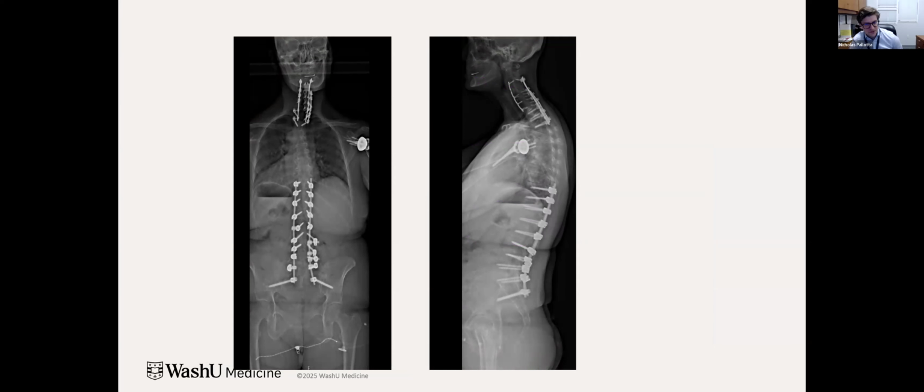And I used patient-specific rods in her, and you can see that whereas in the previous case I had a lot of coronal bend in the rod, especially on the left here, you could see laying in a straight rod and using offset connectors to maintain that, and then placing the other rod as straight as possible so that all of the sagittal plane plan goes into the spine rather than into simply getting the rod to match the screws. You can see it's not perfect though. There's still some coronal bend. Did that affect the sagittal plane here?